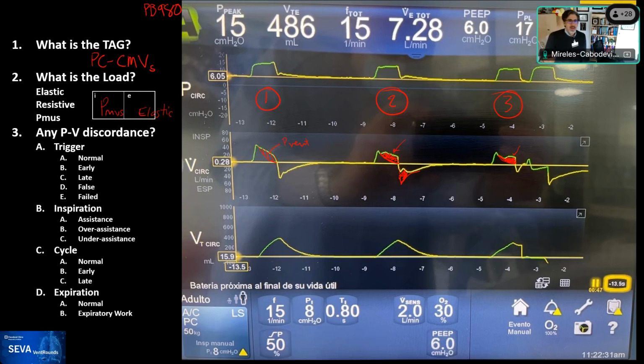All right, Jorge, all yours. Just wanted to highlight those couple of comments. Yeah, also, well, okay. So also, Rob asks a question: how does this ventilator indicate patient versus machine trigger?